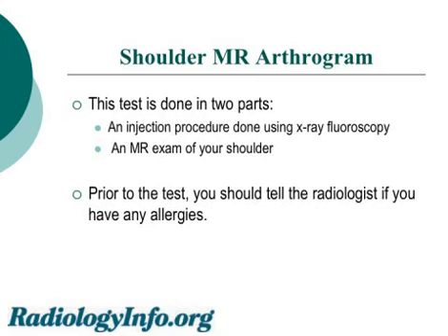An injection procedure is done first using X-ray fluoroscopy, which allows selection of an injection site, and then a second part, an MR study of your shoulder, is performed. Before the test, you should be sure to tell the radiologist if you have any allergies.